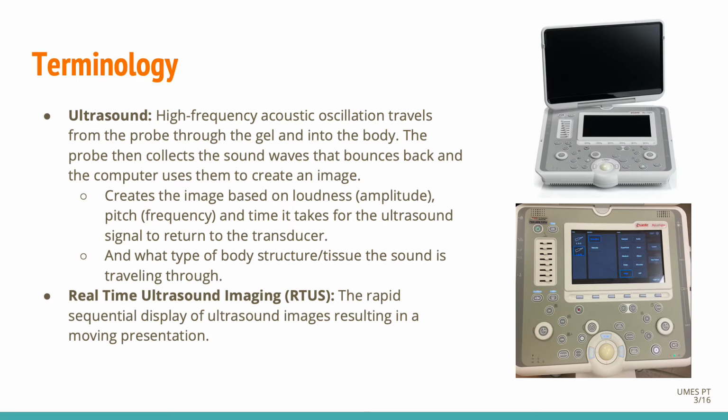So let's start with some terminology. Ultrasound is a high-frequency acoustic oscillation that travels from the probe through the gel and into the body. So the probe then collects these sound waves that bounce back, and the computer uses them to create an image on the screen. So it creates this image based on loudness, which is amplitude, pitch, which is frequency, and the time it takes for the signal to return back to the transducer. And what type of body structure and tissue the sound is traveling through also helps create this image.